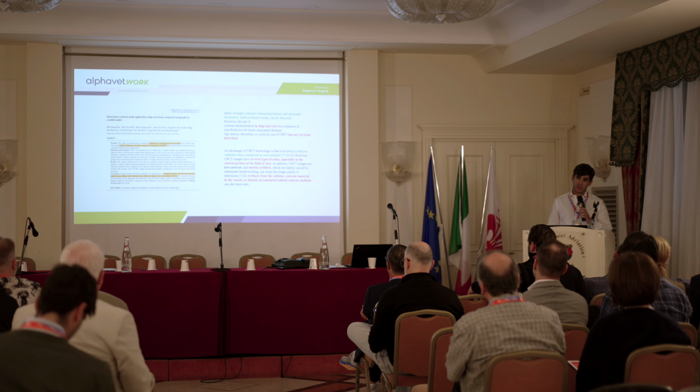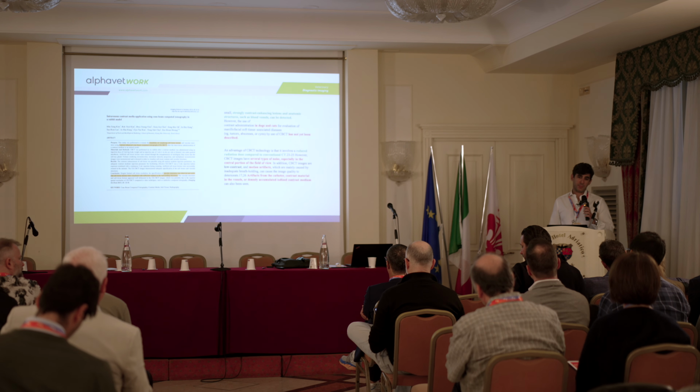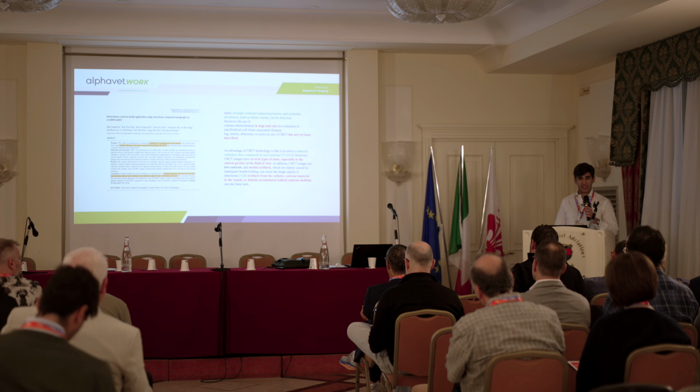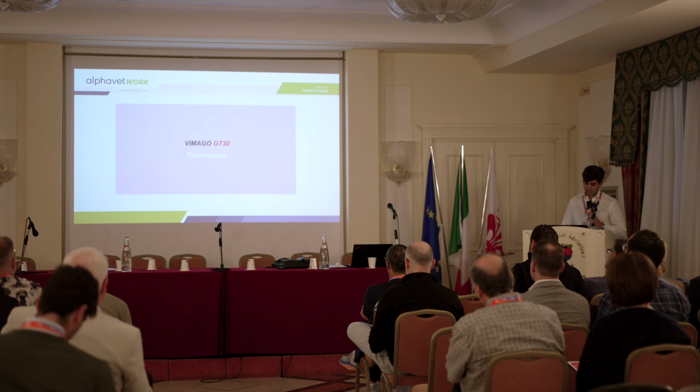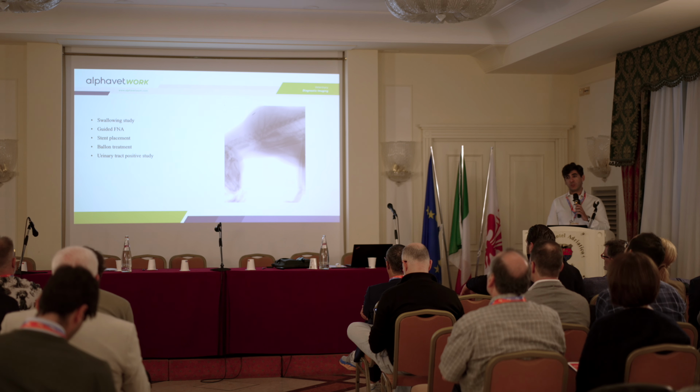better than measuring the Hounsfield units, because also if I measure the Hounsfield units, I have to do an FNA or biopsy. Dynamic CT is not useful, for example, for the hepatic lesions. So whatever the enhancement, whatever the wash in and wash out it is, you have to take samples. So why don't you have a tool that guides you to take the samples? This is what the fluoroscopy will help you.